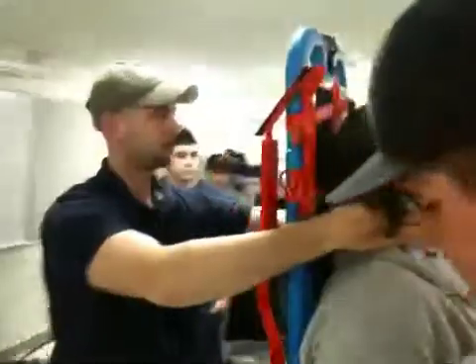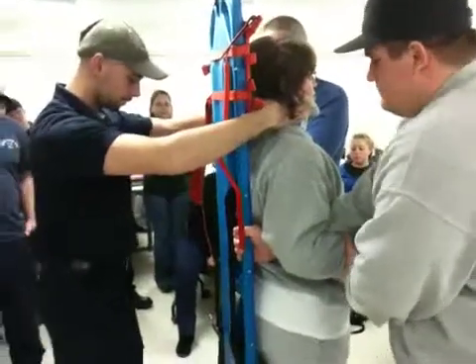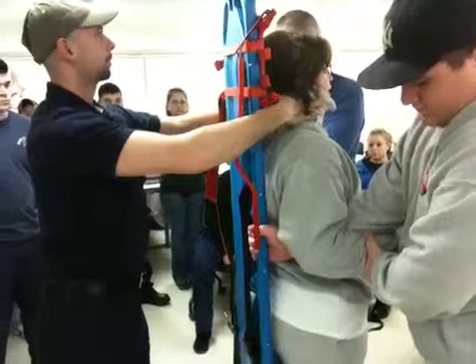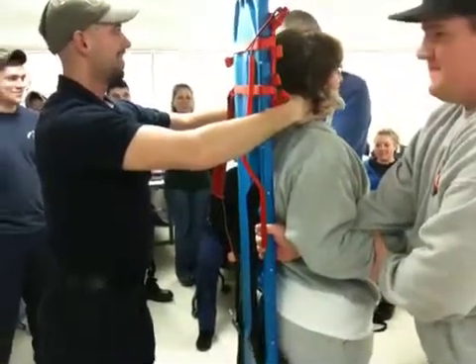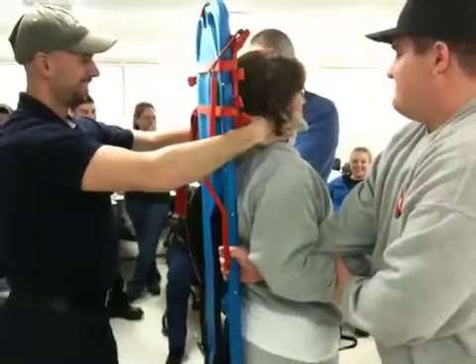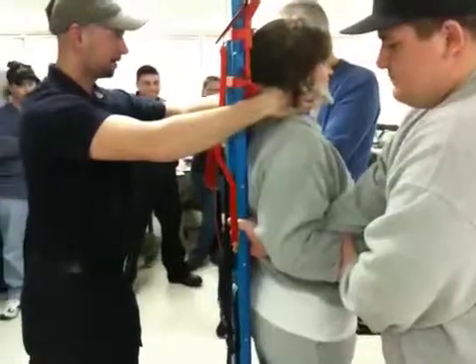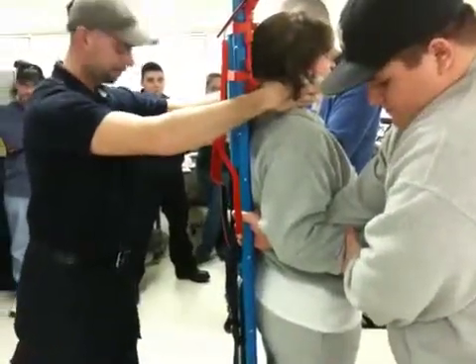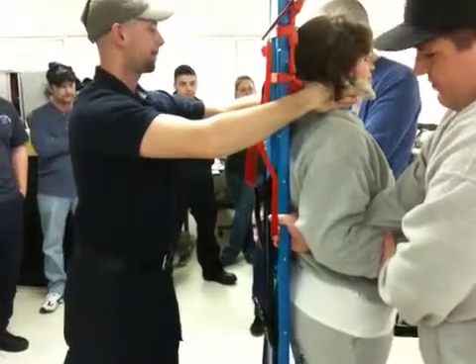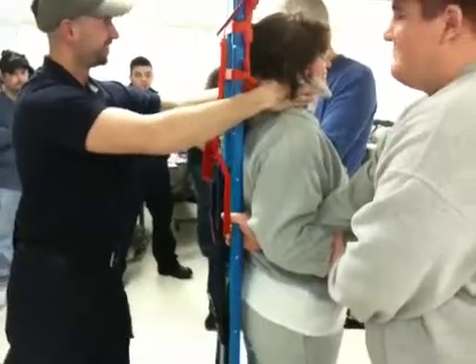Now, I will need to explain to my victim what we're fixing to do. Ma'am, we're fixing to roll you down on the spine board, you're going to have a sensation of falling, but you're not. We're here from the government, we're here to help. Okay, so you want to tell them exactly what they're going to do. It's an awkward feeling because they have no control. But I promise you, it's so simple. They're apprehensive, so you want to tell them exactly what you want to do.